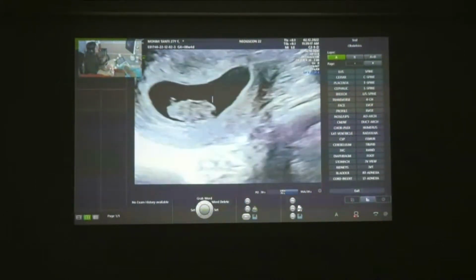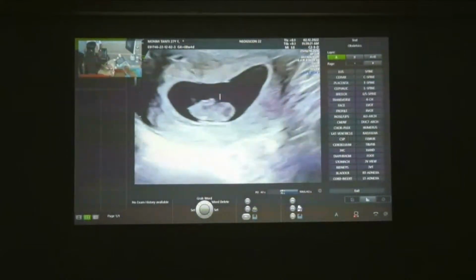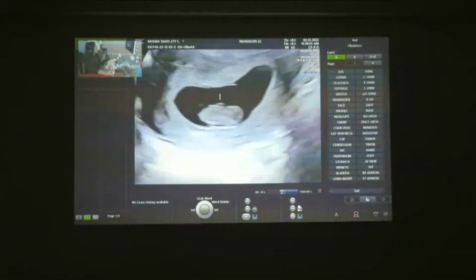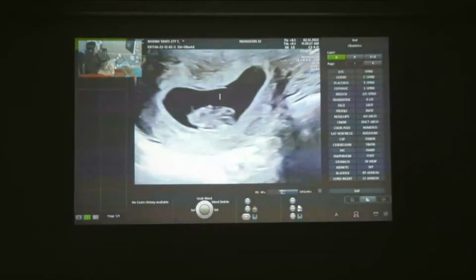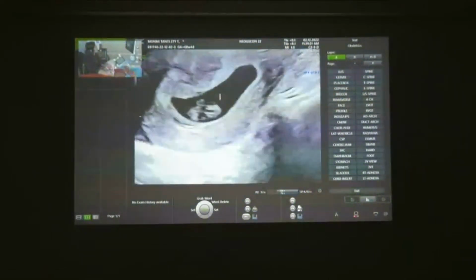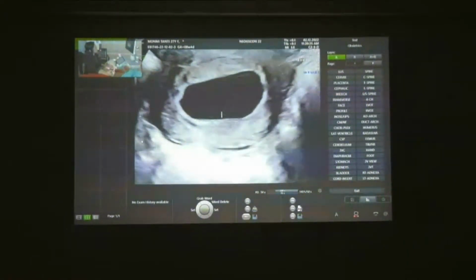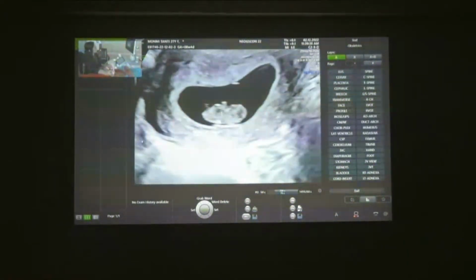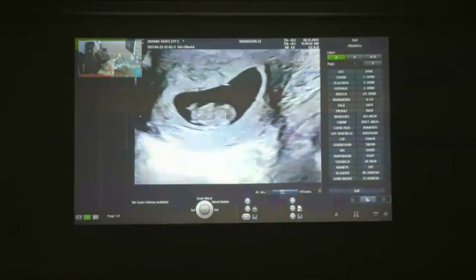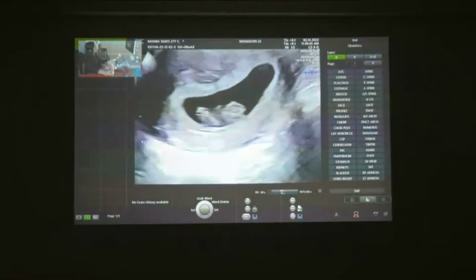But when we see an umbilical cord cyst out here, just make a mention of it. Solitary umbilical cord cysts are usually transient and need to be followed up. So in this scan, it is just important to document the heart rate, whether the fetus is viable or not, and then look at the intracranial translucency and the limb buds.